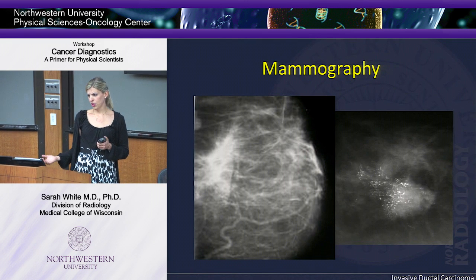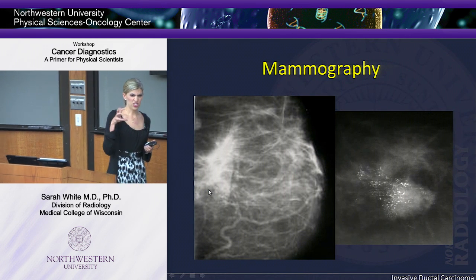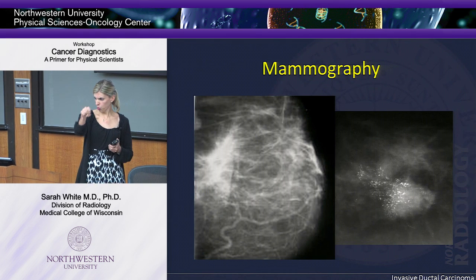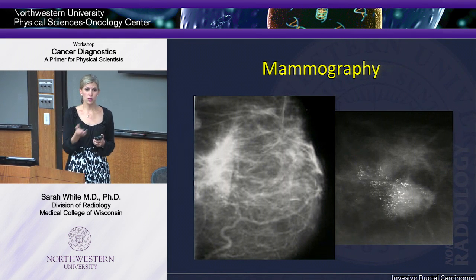So what does a normal mammogram look like? Well, it sort of looks like if you take this part of the screen. But this spiculated mass, this density that I can see, that sort of looks like somebody crunched it or pulled on the tissue, that's what breast cancer looks like, okay? So we have a bunch of people sitting in a room, and they see something that looks abnormal.